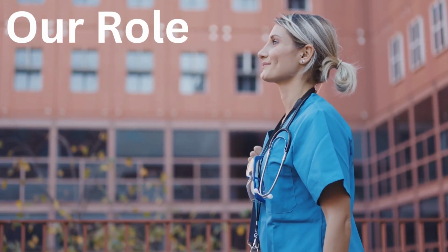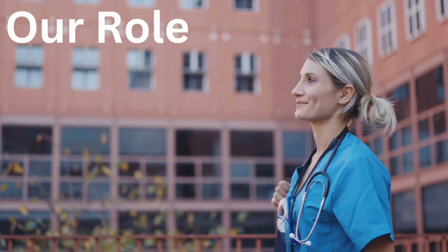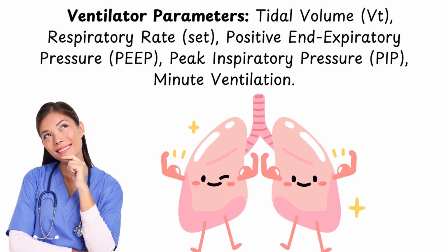Monitoring and assessment. As a nurse, it is important to monitor the patient closely, which includes vital signs and ventilator parameters. 1. Vital signs. Monitoring: heart rate, blood pressure, respiratory rate, oxygen saturation. Second, ventilator parameters: tidal volume, VT, respiratory rate set, positive end expiratory pressure, PEEP, peak inspiratory pressure, PIP, minute ventilation.